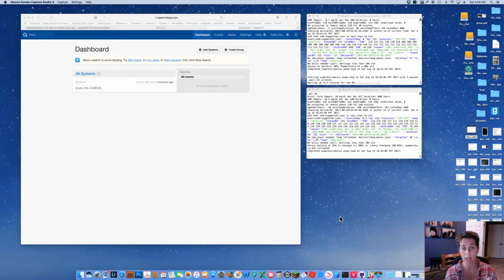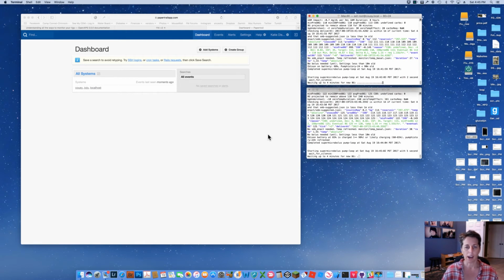So anyway, on this effort, I have preset a couple things up. I have two rigs running right now. One is called cousy and one is called JoJo. They're both logged in on terminal. I have them SSH'd in, but they're both sitting right here, right by the pump. We'll have good tuning while we're at it. But they're logged in, and you can see right now we're watching the pump loop go by. They're scrolling through and going through things.